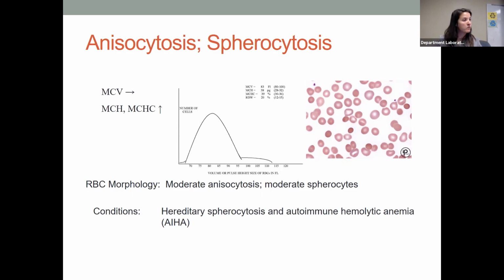Aren't there two peaks like in that? It's just not a very extreme case. It would have to be where you're getting two predominant cell populations to have the bimodal peak. This, you're saying probably the predominant is spherocytes, but you do have quite a bit of polychromatic erythrocytes too.